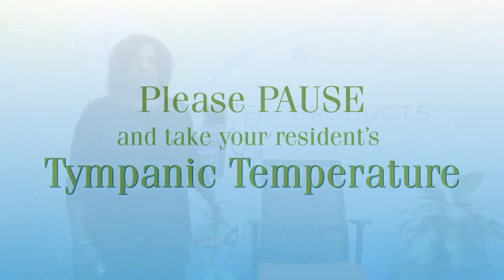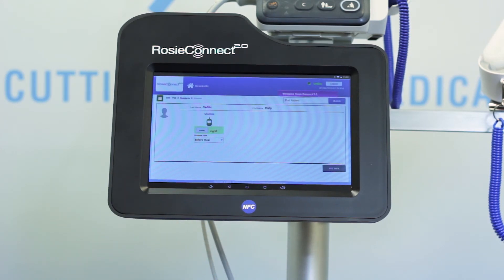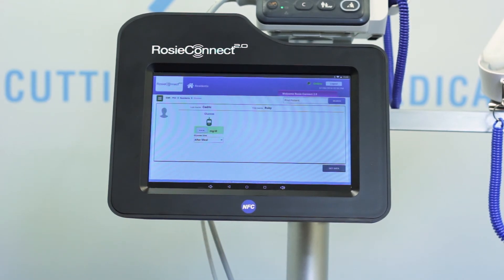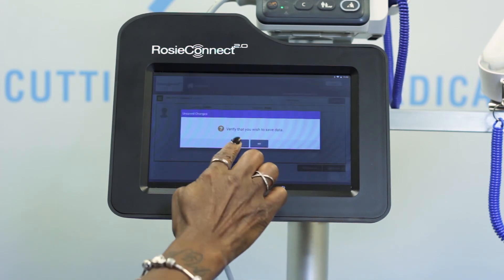We're going to take a break here so you can take the resident's temperature using a tympanic thermometer. Next, I'm going to show you how to use the ROSE Smart Meter Glucometer. For purposes of this video, we are assuming that you have already run your controls, taken your resident's blood sample, and ejected the strip. On the tablet, find a resident and select the correct resident. Select the glucose icon and then select the correct option — before meal or after meal. Then hold the ROSE Smart Meter face down directly on the NFC on the front of the tablet and hold it there until you see numbers populate on the tablet. Once your numbers are in, save data and verify that you want to save the data.